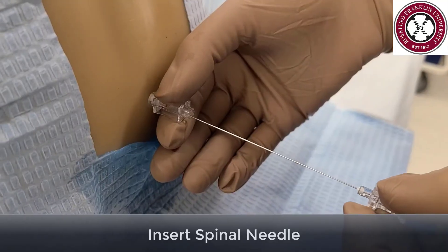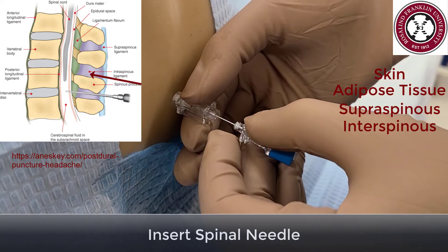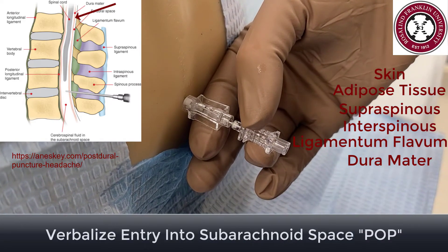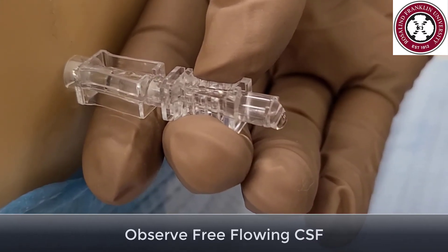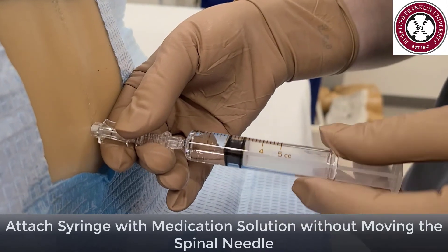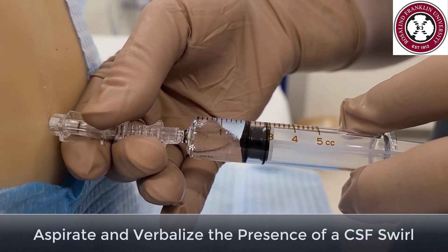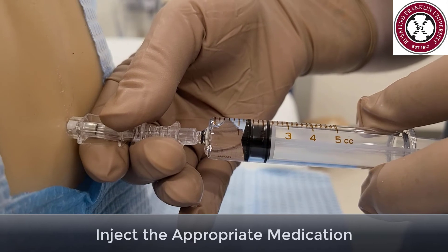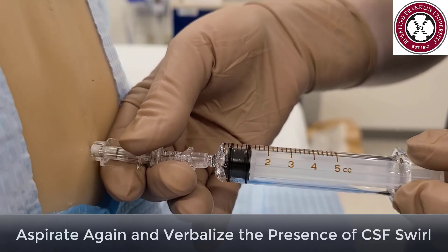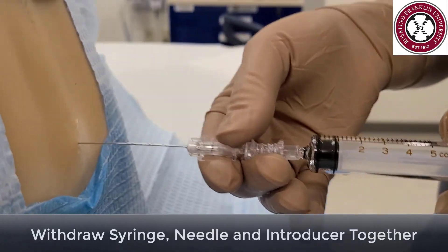Insert the spinal needle with the bevel up. The needle will pass through skin, adipose tissue, the supraspinous and interspinous ligaments, and the ligamentum flavum before passing through the dura with a popping sensation. Remove the stylet and observe the free-flowing CSF. Grab the 5 ml syringe and attach it securely to the spinal needle. Aspirate and verbalize the presence of the CSF swirl, then slowly inject the medication into the intrathecal space. Once you have injected all of the medication, aspirate again and verify the presence of the CSF swirl. Withdraw the syringe, needle, and introducer together.